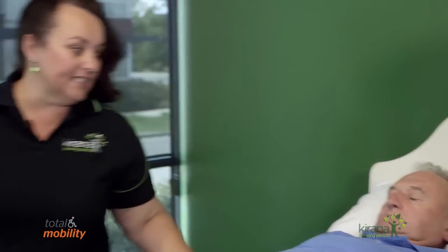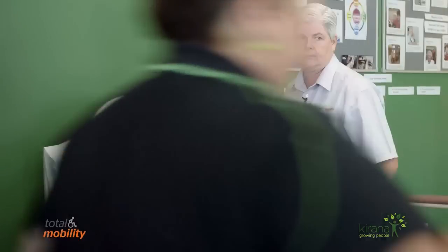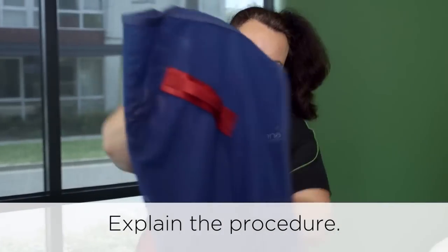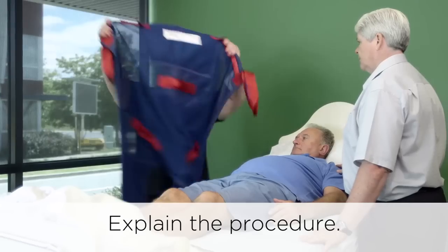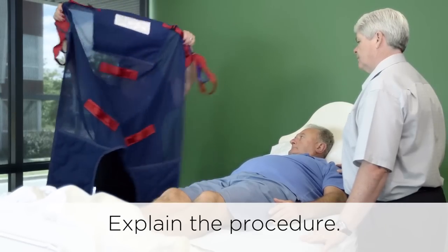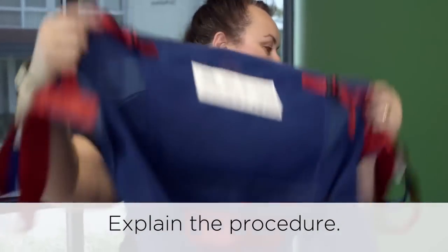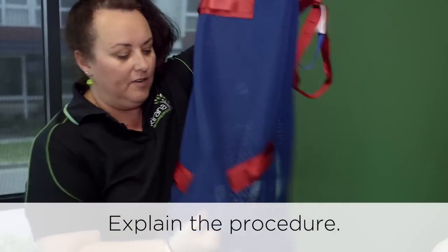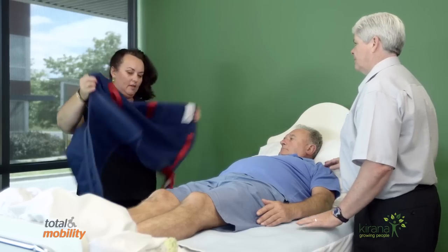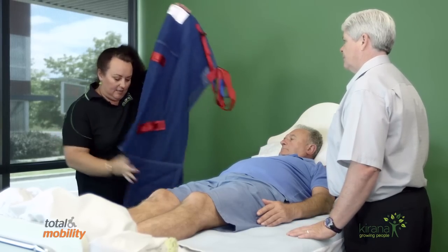Mr. Williams, have you ever been in a hoist before? No. Let me show you what the sling looks like. So this is a sling — I'll open it up so that you can see it. And we're going to place this underneath you when we roll you over. To do that we need to fold the sling in half with the straps on the outside.